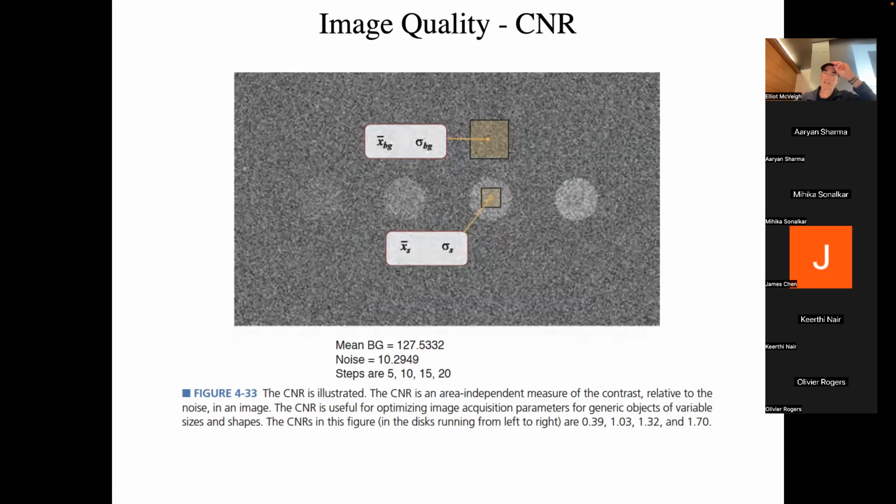All right. Good morning. We'll pick up where we left off on Monday, and we're going to continue looking at what factors affect resolution and image quality and signal to noise and things like that in terms of the sampling and how you do that with CT.